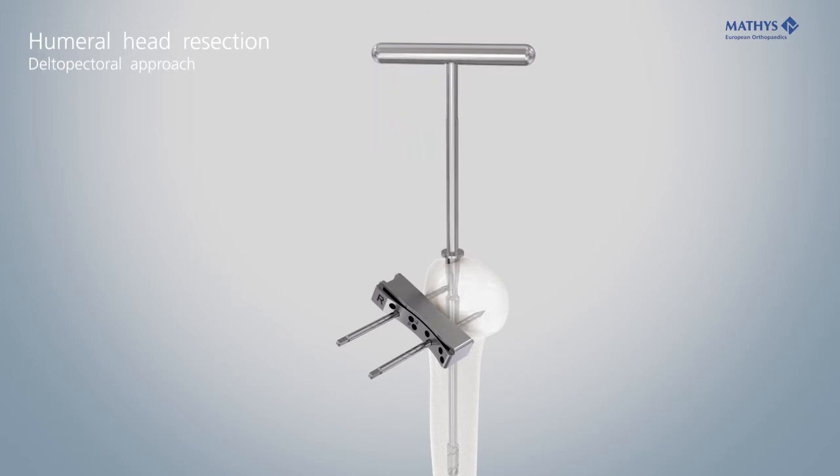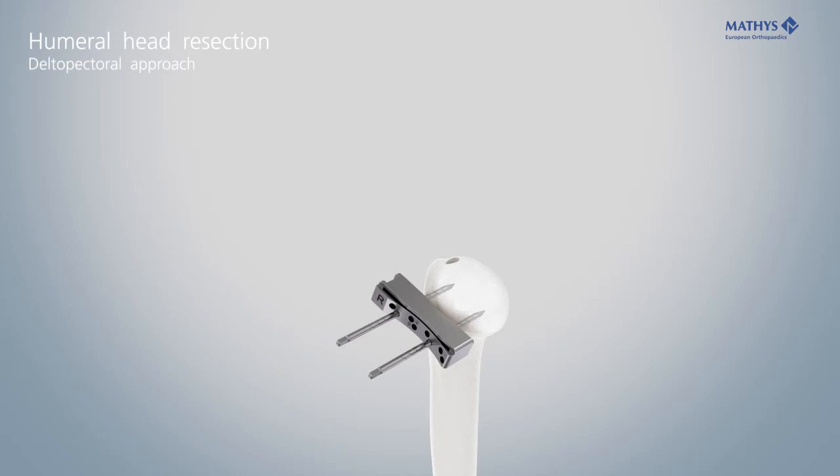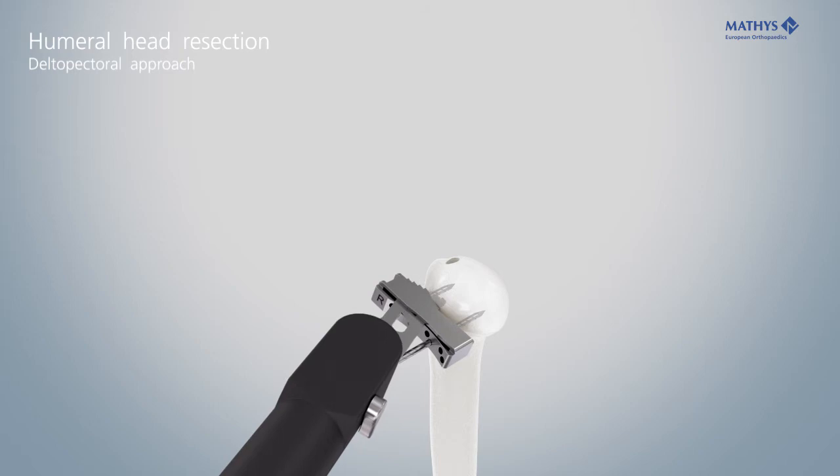If necessary, use the stylus again to check the resection height and retroversion once more. Resect the humeral head through the slot of the cutting block.